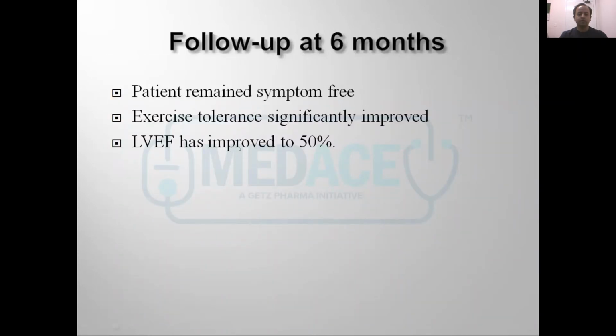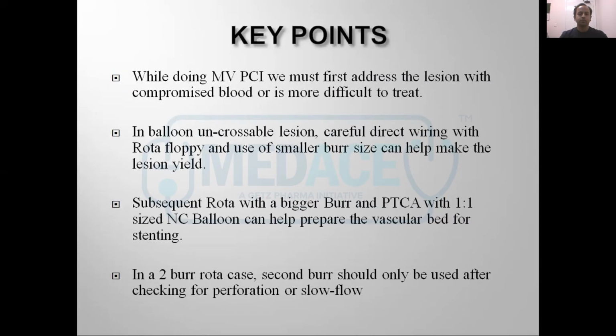So this is the final result of our PCI to the circumflex. At follow-up, the patient has improved EF and improved symptoms. Just to conclude, while doing multi-vessel PCI, we must first address the lesion compromising blood flow, or the lesion which is more difficult to treat.